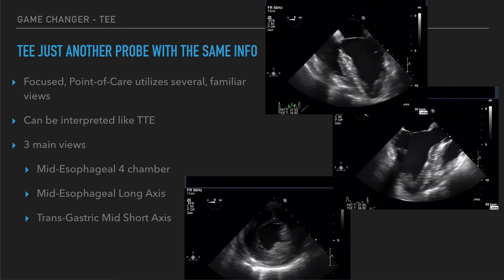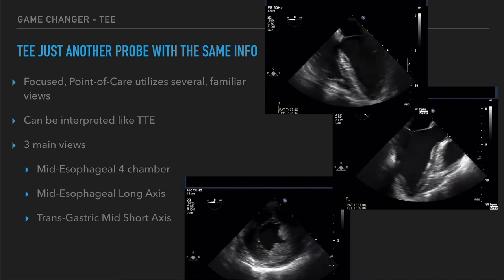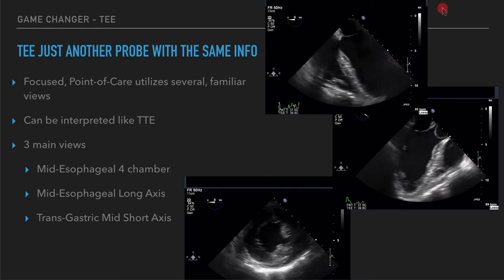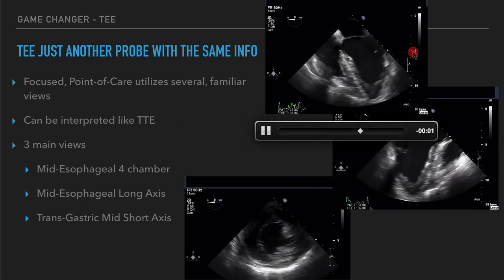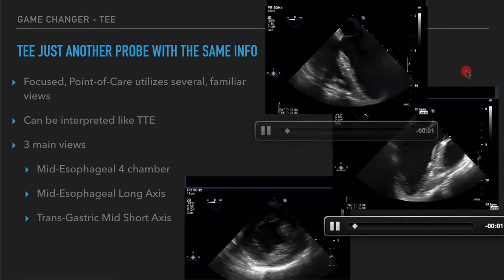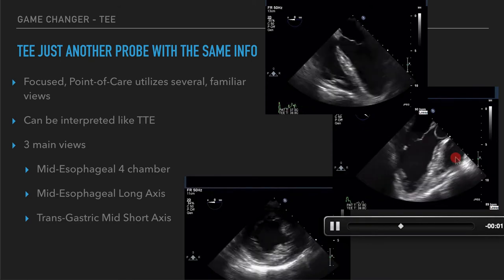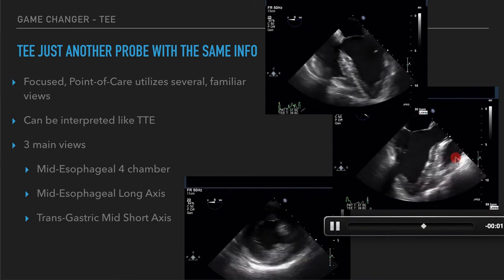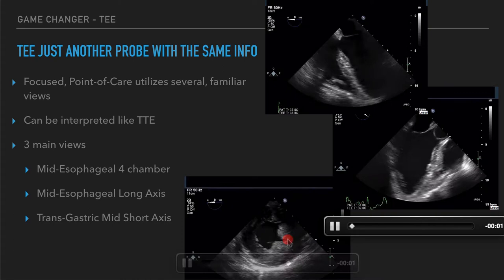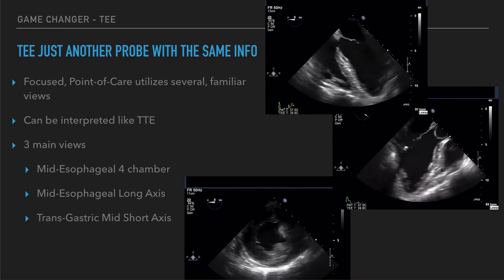TEE is really just another probe with the same information that we're trying to acquire, so these views should be pretty familiar-looking. The mid-esophageal four-chamber view should look pretty similar to your apical four-chamber on transthoracic echo. The mid-esophageal long-axis view should look a lot like the parasternal long-axis view you've seen many times. And the transgastric short-axis view is analogous to our parasternal short-axis view of the heart.